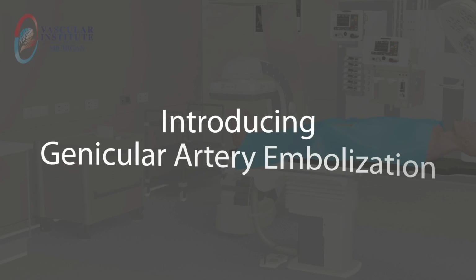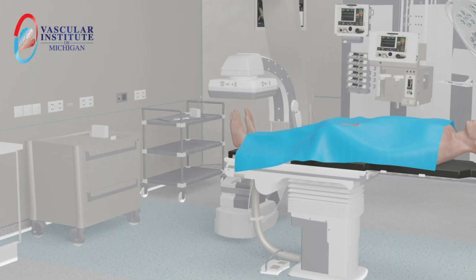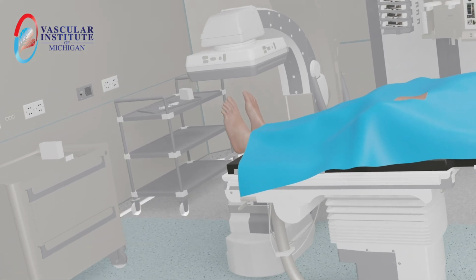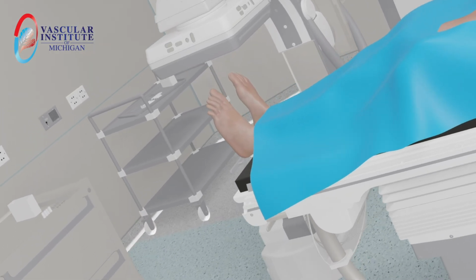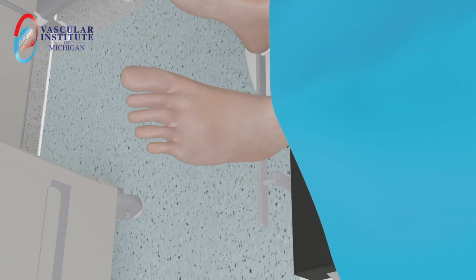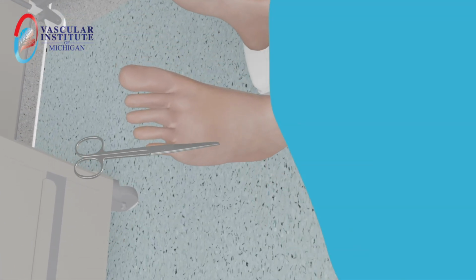Introducing genicular artery embolization, a non-surgical process to treat the pain of knee osteoarthritis. This animation demonstrates how this procedure is carried out step by step through the foot area. Procedure through foot, Dorsalis Pedis Artery.